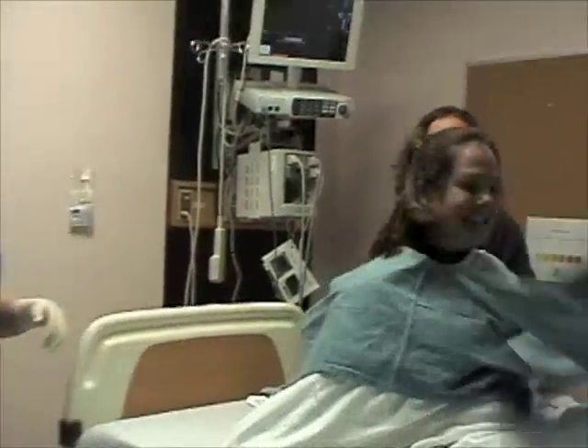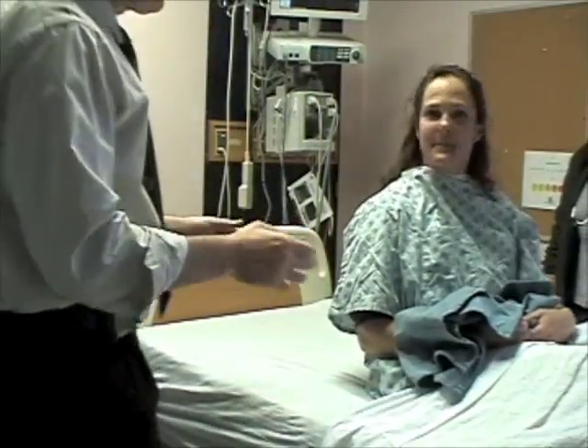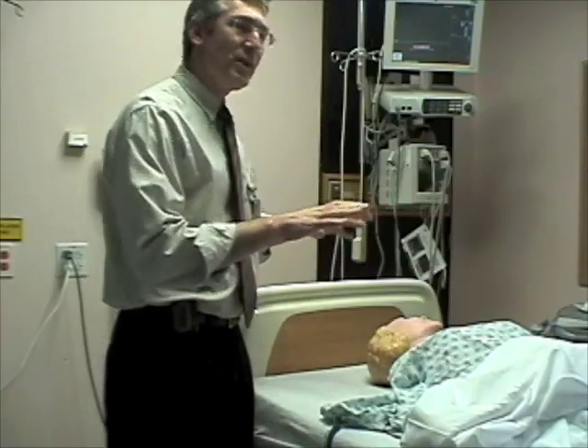Hold on. Don't you know anything about sterile technique? Can I help out here a little bit, guys? What we're going to do is show you exactly how to set up for a central line. Why don't you lie back down. So now what we're going to do is talk about the proper way of actually putting in a central line, and this is really geared towards sterile technique rather than the exact technique of putting in the central line, because many of you have already learned that over the years. But what I've found is that proper sterile technique has been less than adequate in many situations.